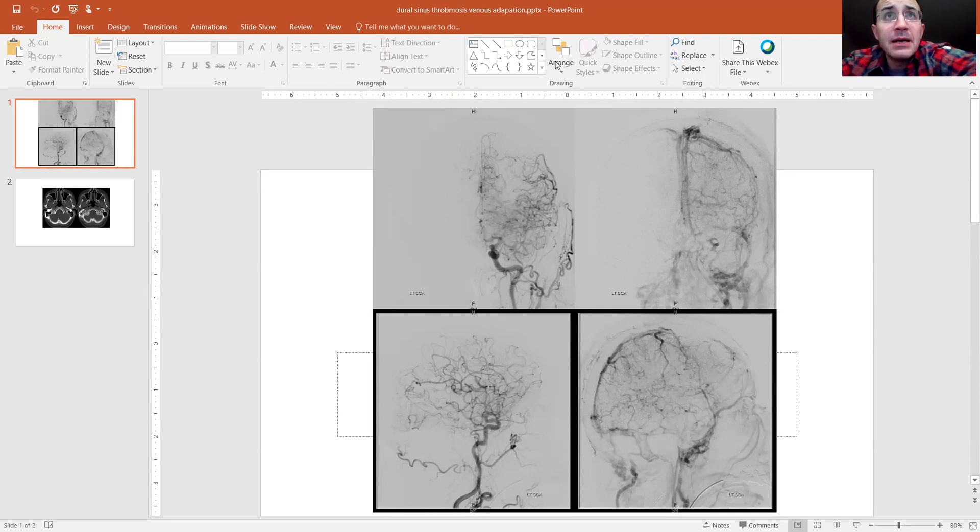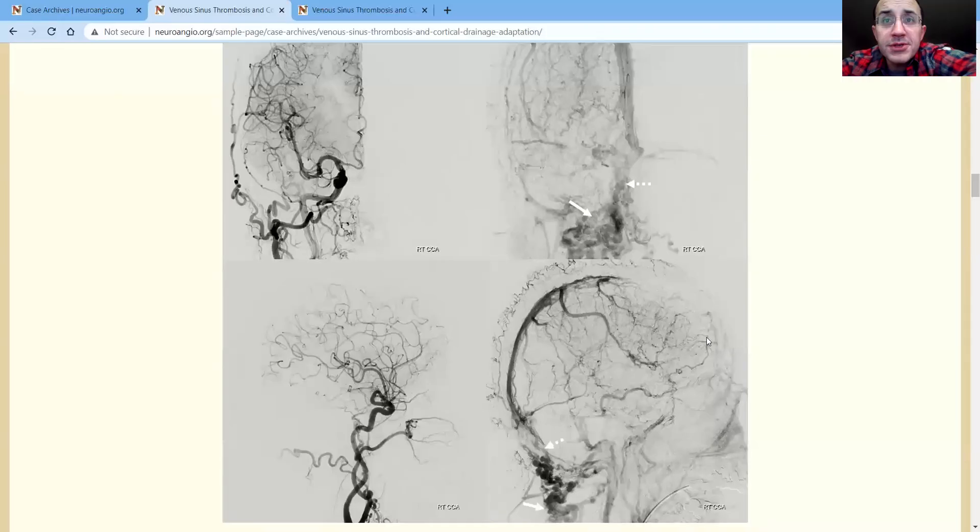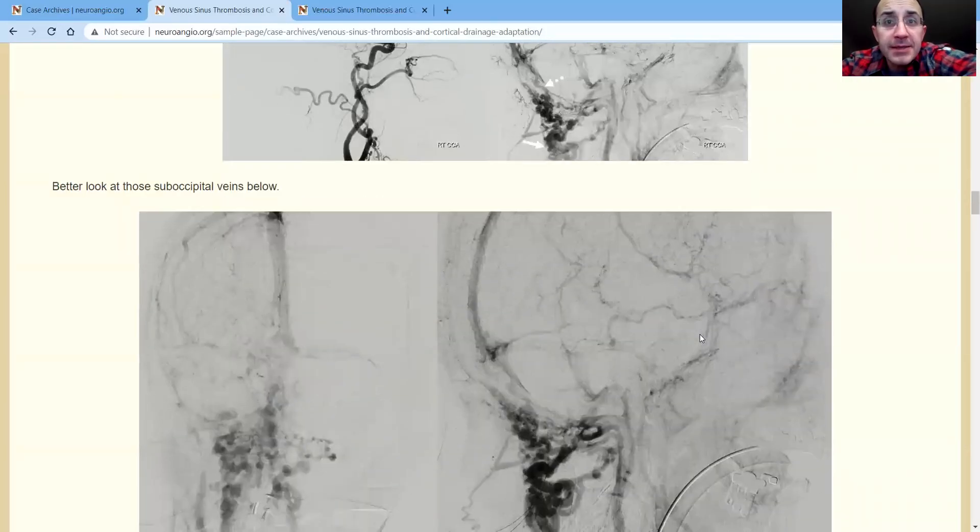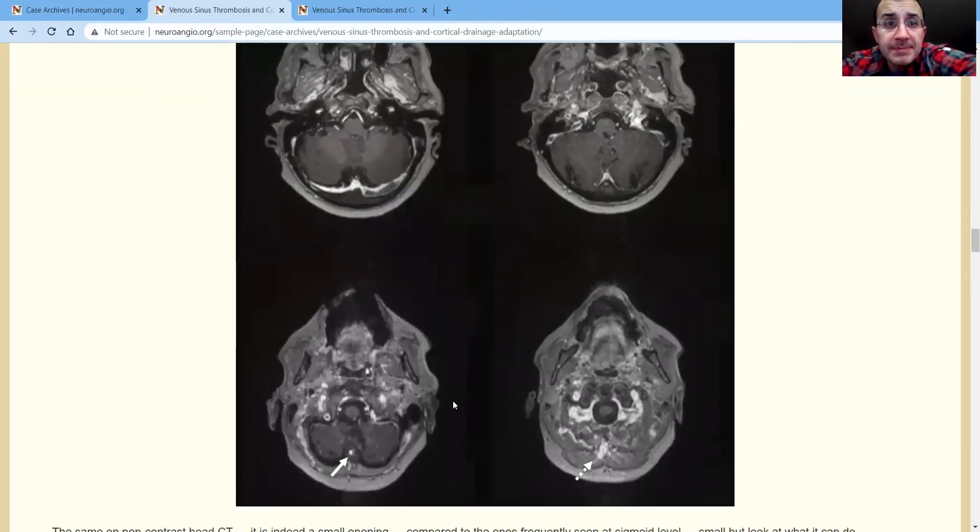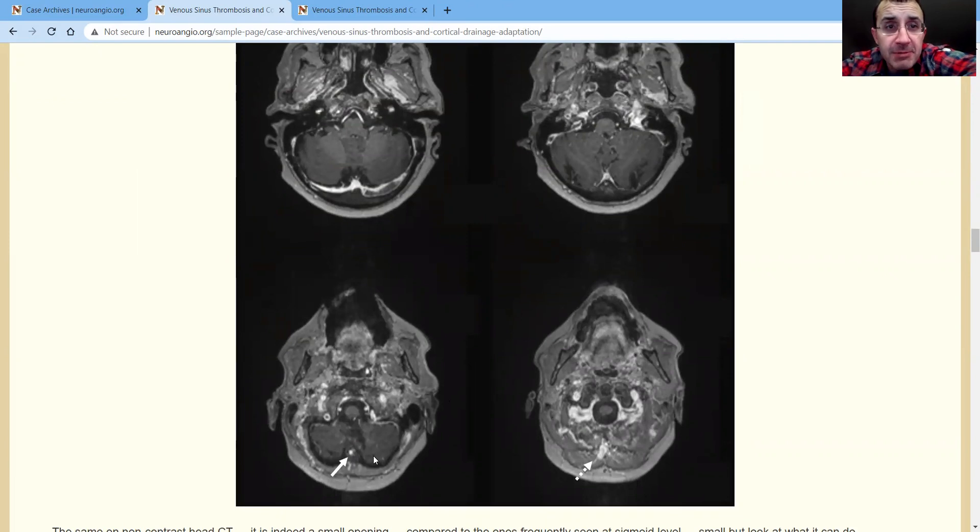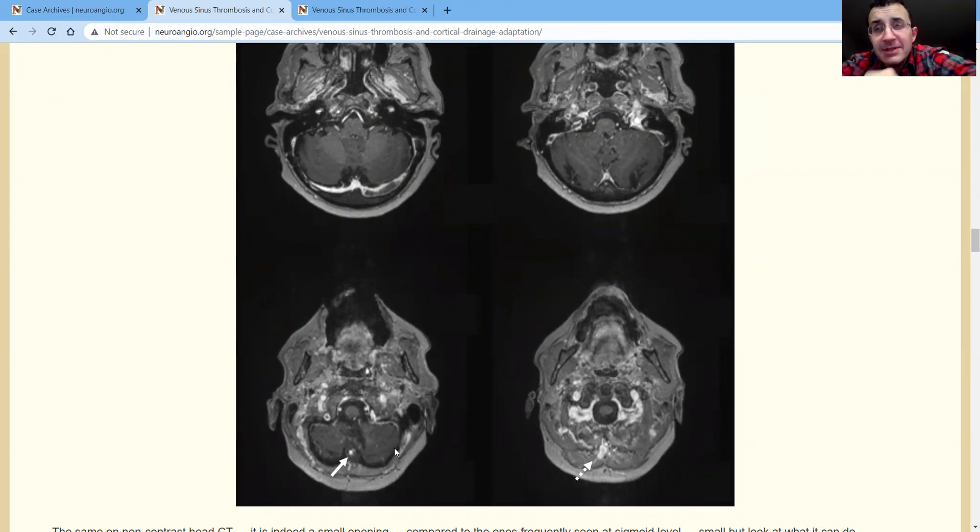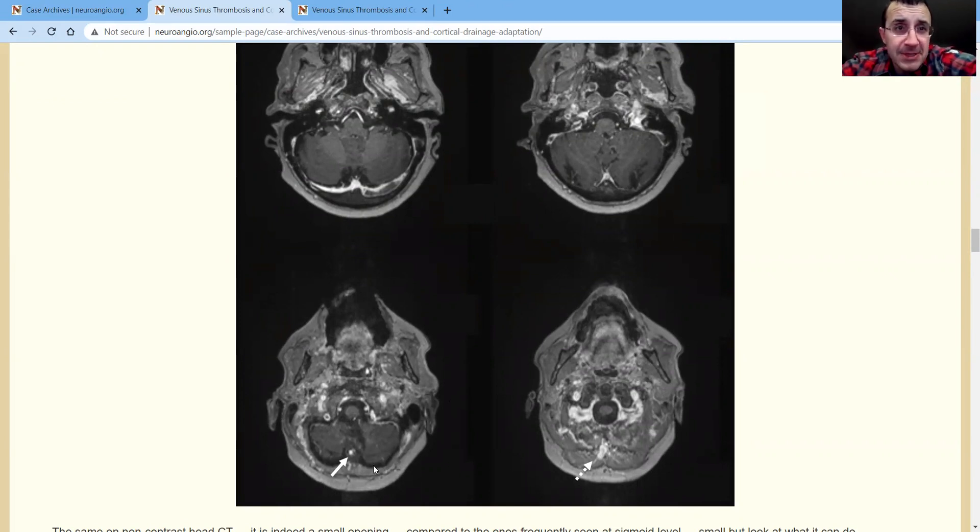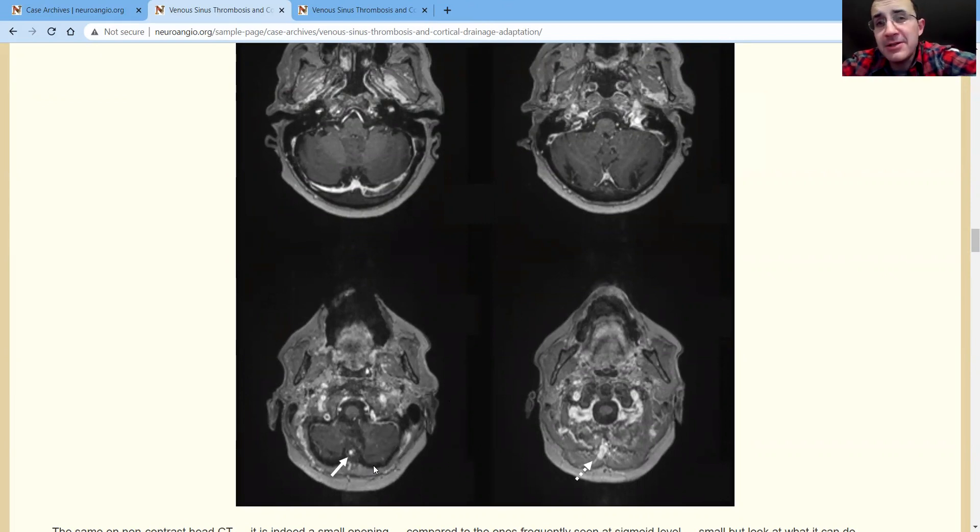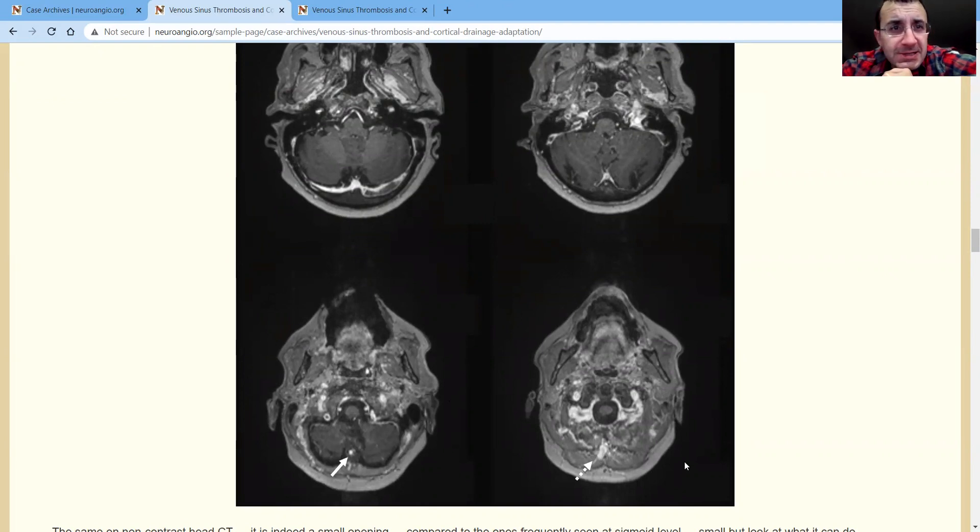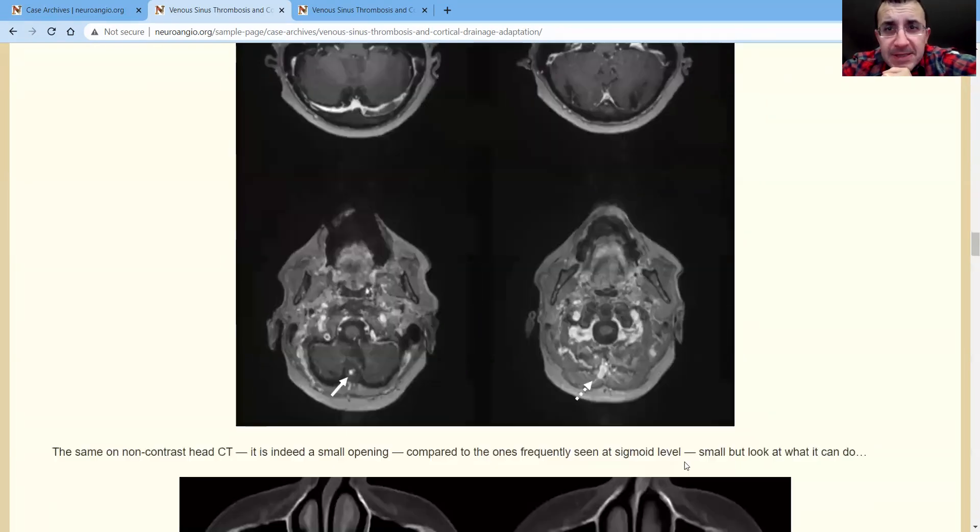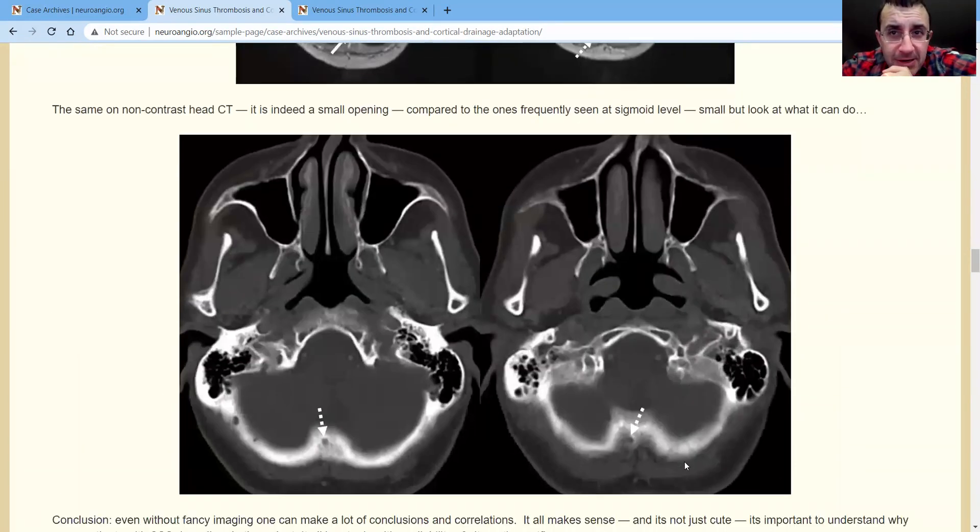Now, when we go back, we're going to share this screen now again. We're jumping back here. Go back to the MRI. You can see on the MR, this is that emissary vein, which I keep harping on because they're so important. This tiny little vein. This is one of the importance of this case. We don't really talk about all these alternative outflow. It's just a jugular cavernous, but there's lots of little holes that can be life-saving in situations like these. You see how small this is, but it's tremendous flow going through that, and that's keeping her in decent shape.